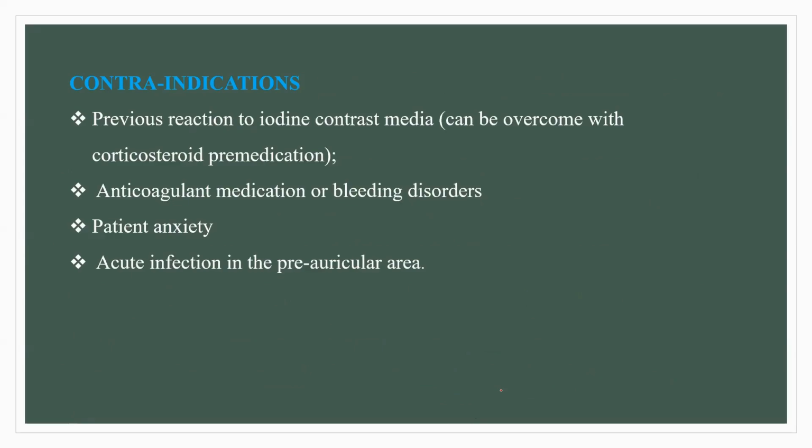What are the contraindications? We know that we use some contrast media, right? So if there is any previous reaction to iodine contrast media, we cannot use arthrography.